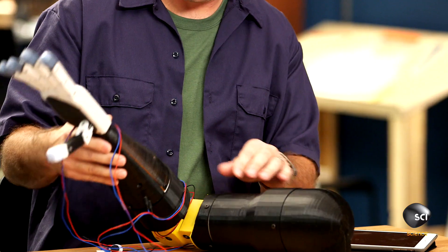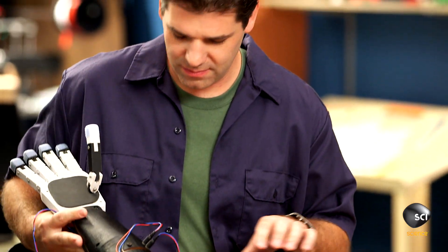I'm proud to introduce the RoboArm. RoboArm is a completely open source, 3D printable robotic arm that weighs under 10 pounds.